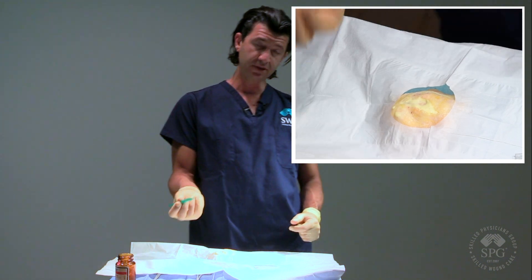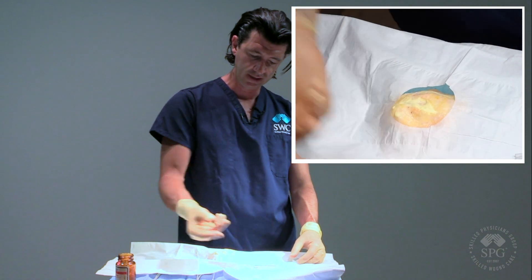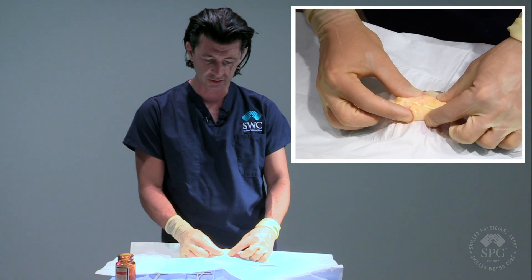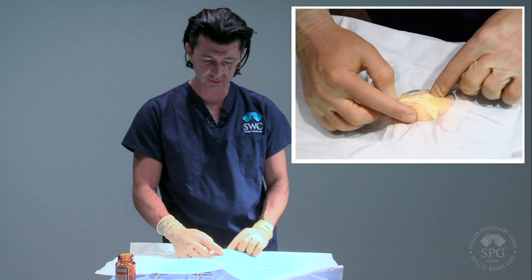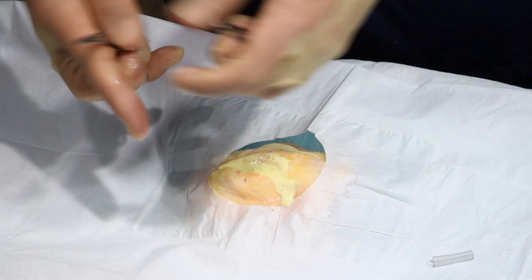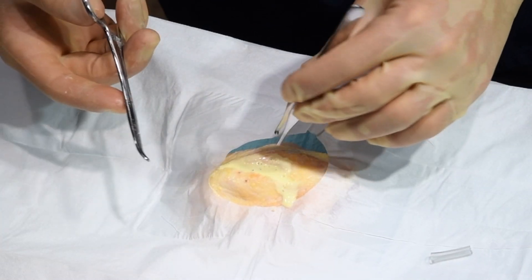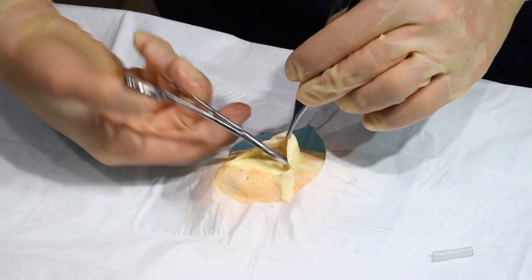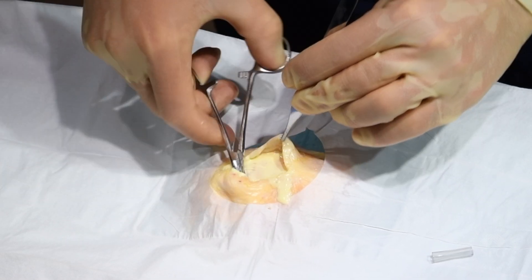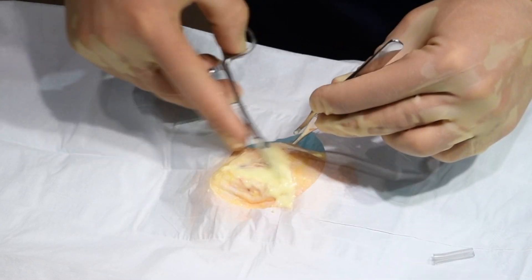The next thing you want to do is be very careful with your sharps, so I'm going to put my scalpel away. You can see all of the fluid here, and then you can express the fluid out, or you can use your forceps along with a curved hemostat or a flat hemostat to open the pockets up underneath the skin and really make sure you're getting everything out.